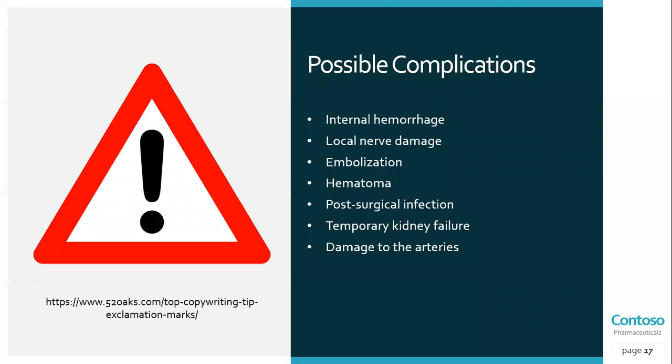Possible complications that may be associated with any percutaneous transarterial catheterization include the following: internal hemorrhage, local nerve damage, embolization, hematoma, post-surgical infection, temporary kidney failure, and damage to the arteries.